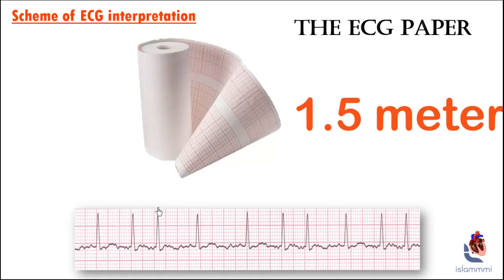That's not possible, so we have to find another, easier way. They give you only one sheet of ECG paper, which is almost 30 centimeters. So how can I calculate the heart rate if it is irregular? Why do we say irregular? Because if you check the distance between the R waves, they are not the same. So this is irregular. The first method cannot be applied here. So what are we going to do?